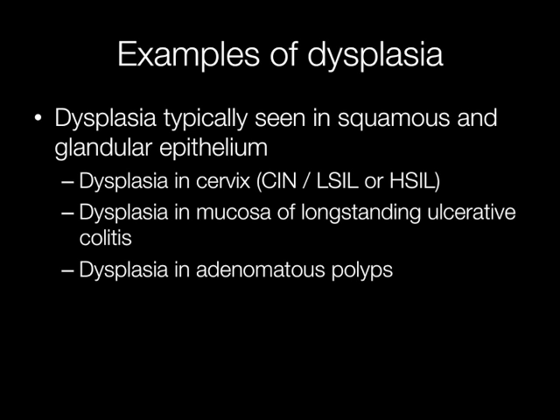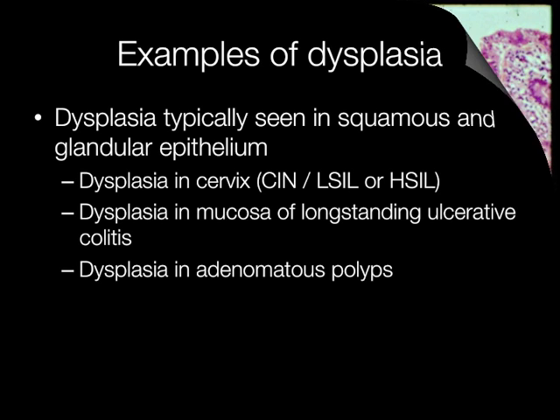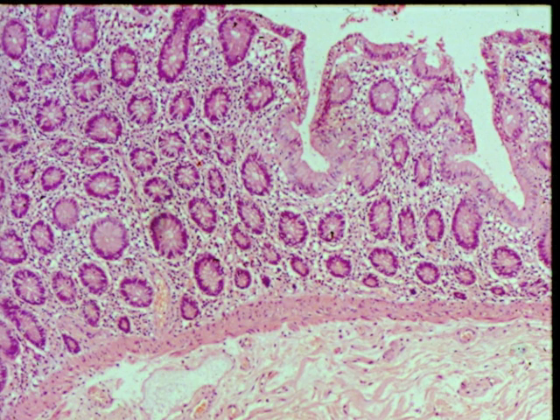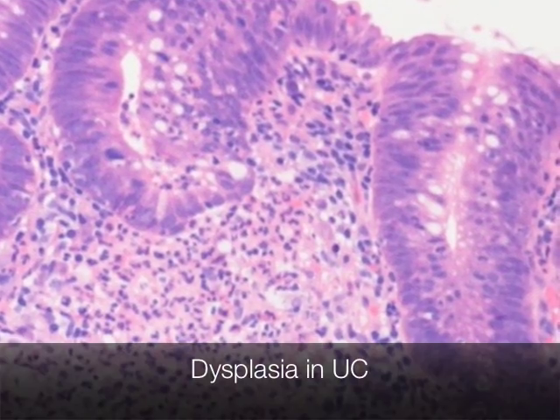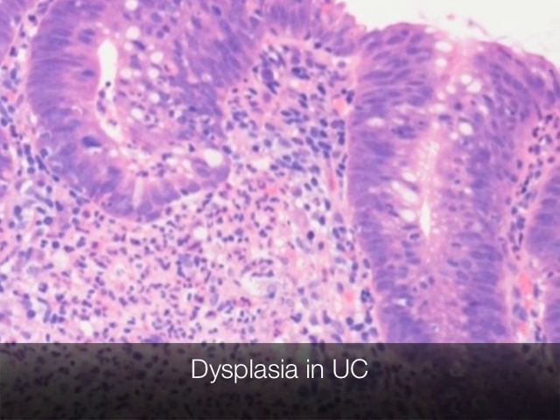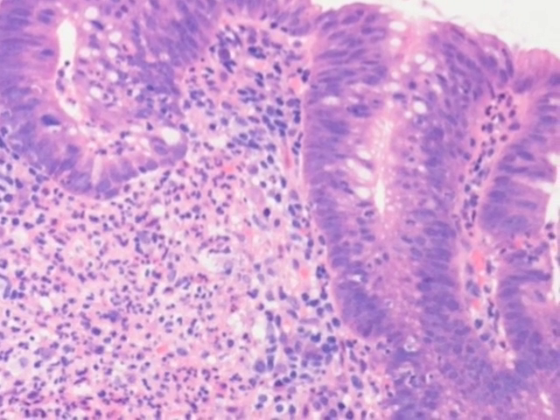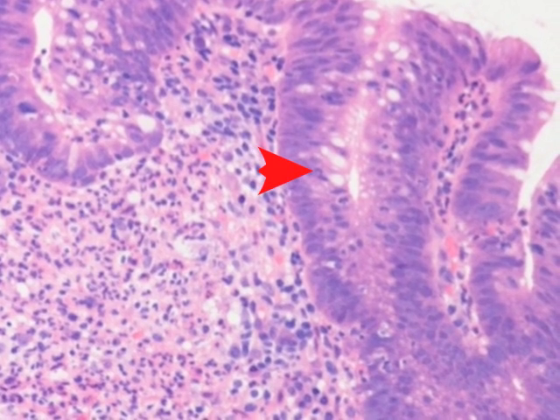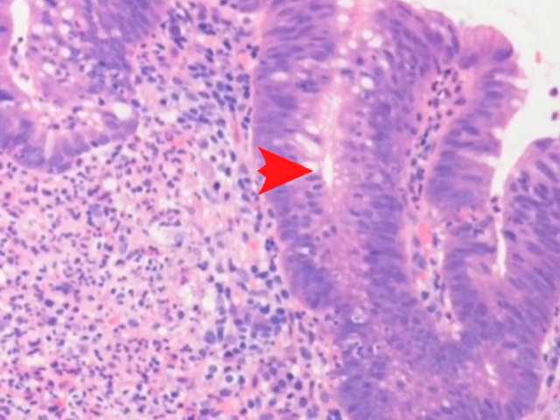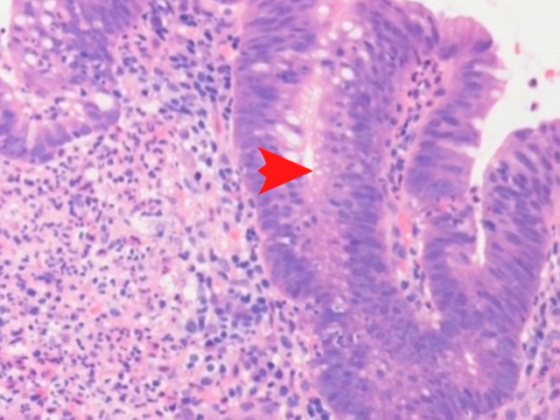Dysplasia may develop in the mucosa of patients with long-standing ulcerative colitis, and dysplasia is always seen in adenomatous polyps. This is a biopsy of normal colonic mucosa with regularly spaced normal gland crypts with small regular nuclei. This biopsy from a patient with ulcerative colitis shows nuclei in the gland crypts that are haphazardly arranged, varied in size and shape, and undergoing a lot of mitotic activity — i.e. they are dividing. This is an example of dysplasia.